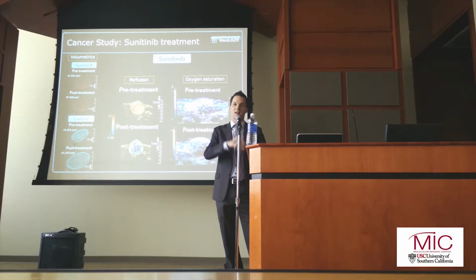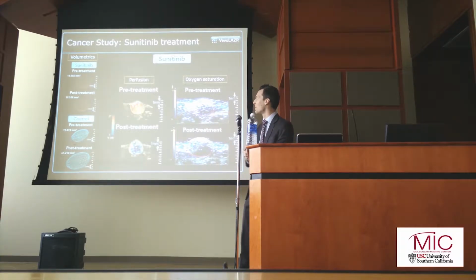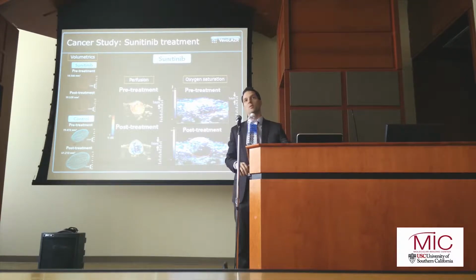So again, just showing this sort of holistic approach that the system has, at least in the context of tumor biology, where we can go from tumor volumes, tumor perfusion, oxygen saturation, and total hemoglobin, and learn more about the physiology and pathology of that disease and the treatment.